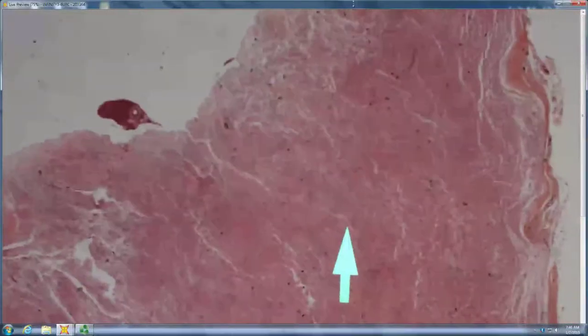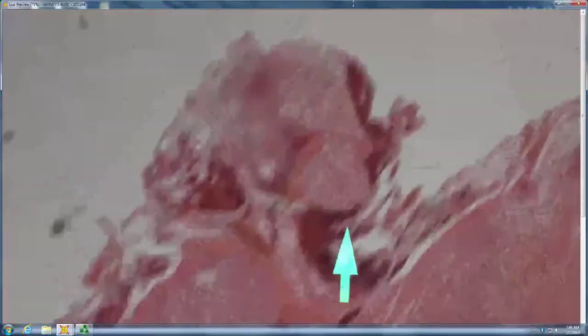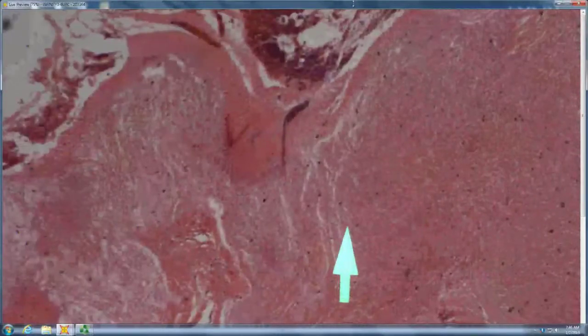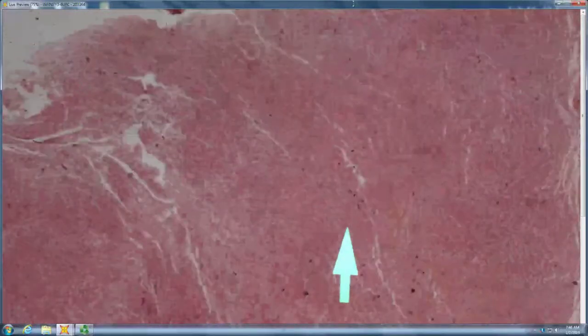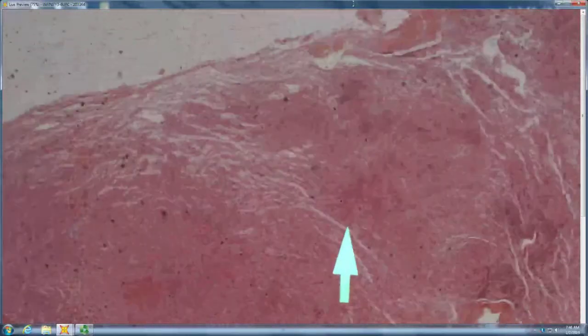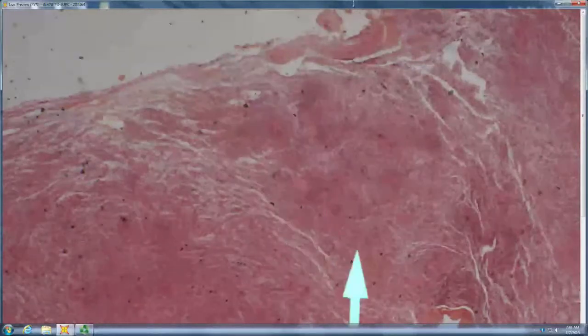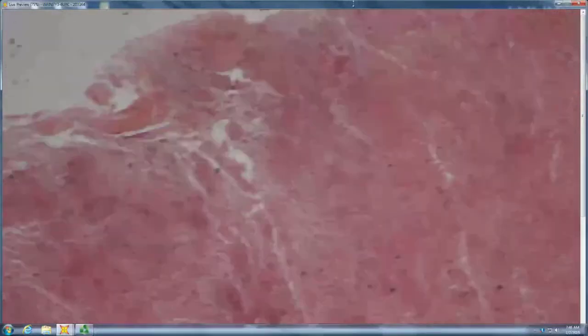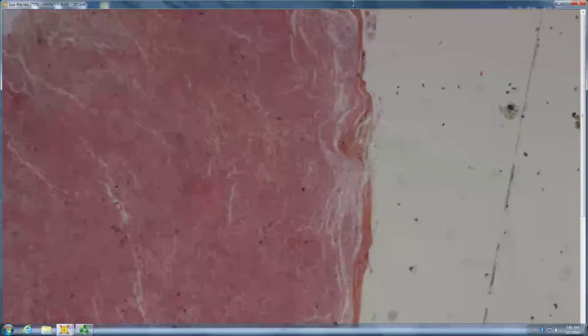Clefts. So you definitely have clefts. The whole thing itself, it's a little deep. I was thinking PEN, or maybe cellular. Yeah, it looks kind of like a big palisaded encapsulated neuroma, right? It definitely has Verocay bodies in it. It is oval. It has a little crescent-like zone of subcapsular edema here. It's a schwannoma.